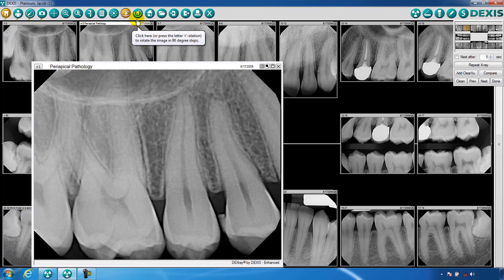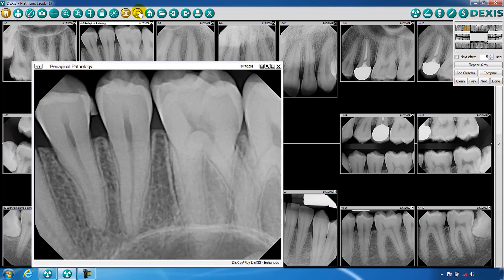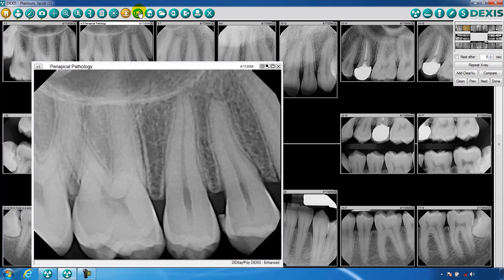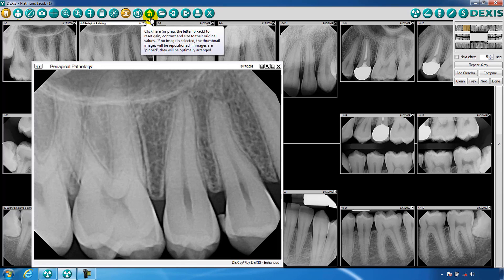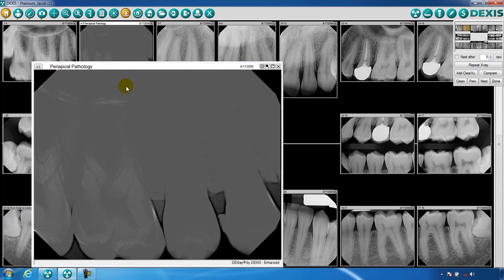The next icon is rotation. This tool enables you to rotate your images. The house or reset function is used to roll back any changes you may have made to an image.